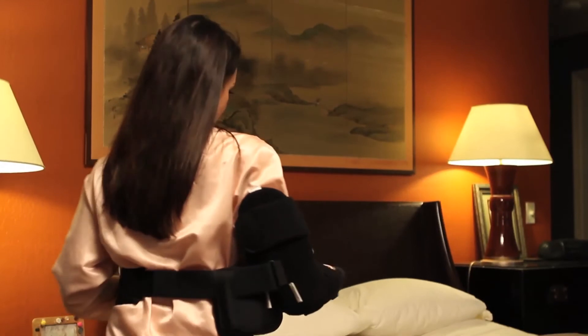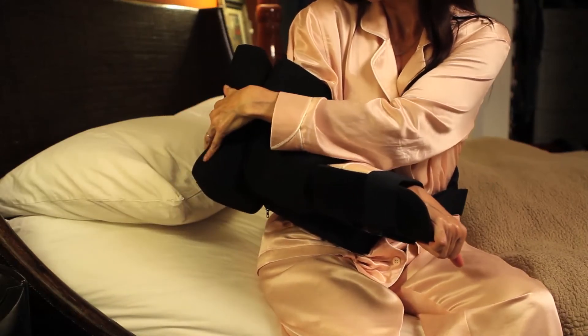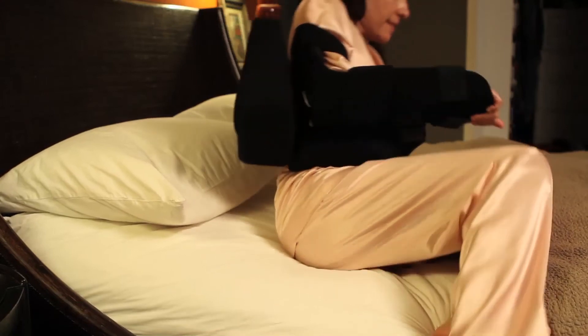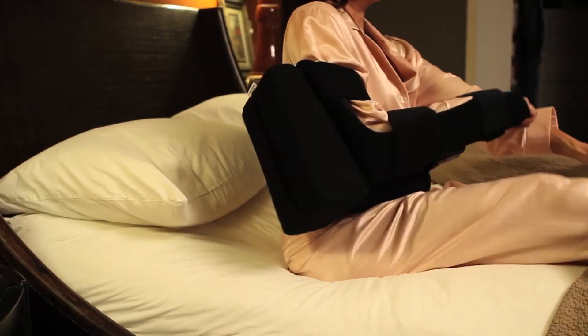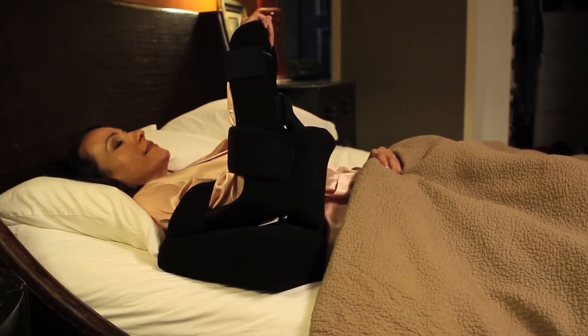The shoulder cradle is specifically designed to provide proper support and alignment while sleeping. For back sleeping, use the smaller wedge-shaped bolster. Attach it to the back of the cradle via the velcro strap with the fat end of the bolster facing down towards the elbow. Then while laying down, proper support is provided in a properly aligned position.